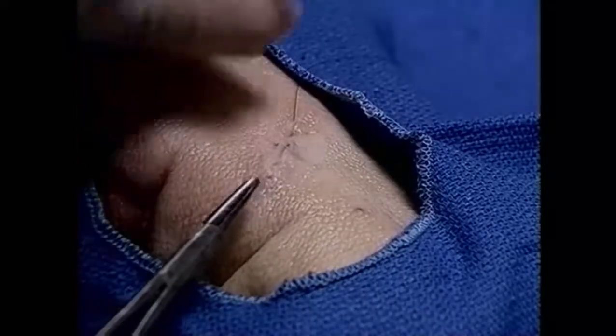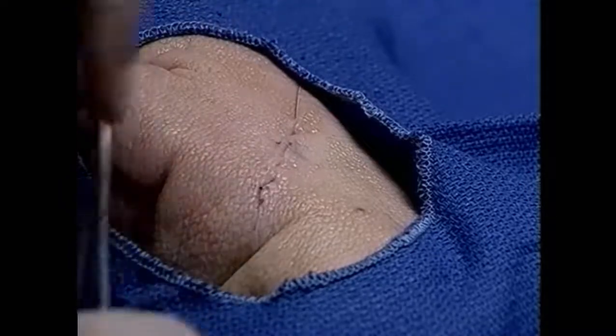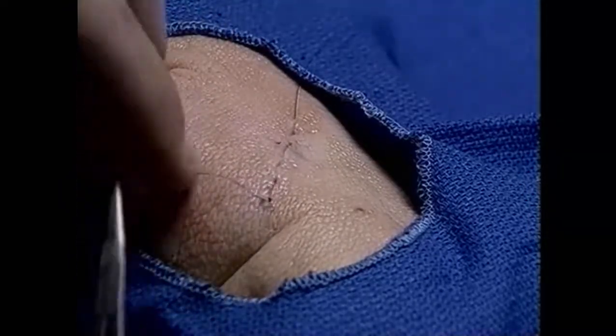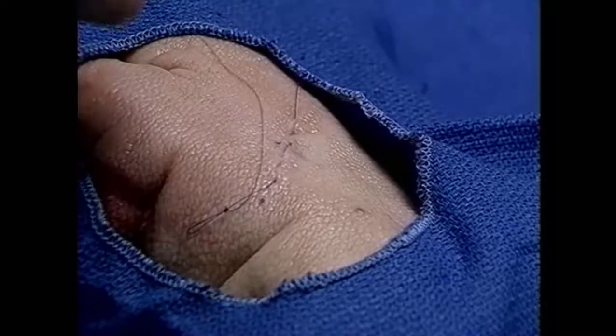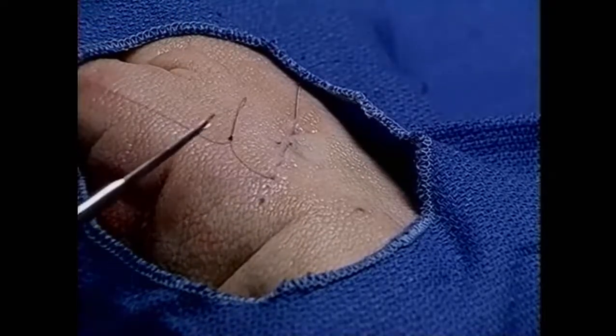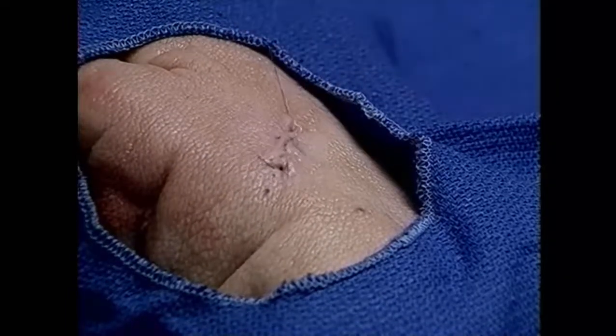To tie it, each side is treated as if you are tying a slip knot. The proximal side is tied off with a small knot, each time grabbing the loop. Usually four knots are all that are needed.